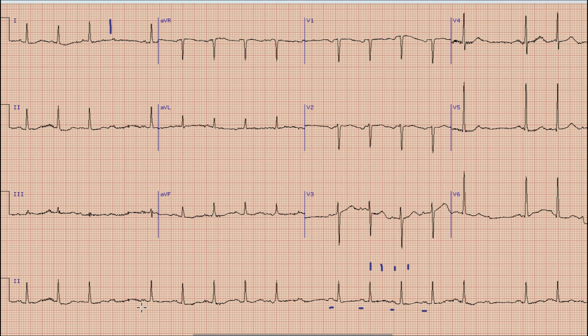Firstly, we look at the PR intervals in conducted beats. We can see that the PR interval in the conducted beats is constant. Among these three differentials, we can confidently say this is not Mobitz I AV block because the PR interval is constant — Mobitz I requires a progressively lengthening PR interval.